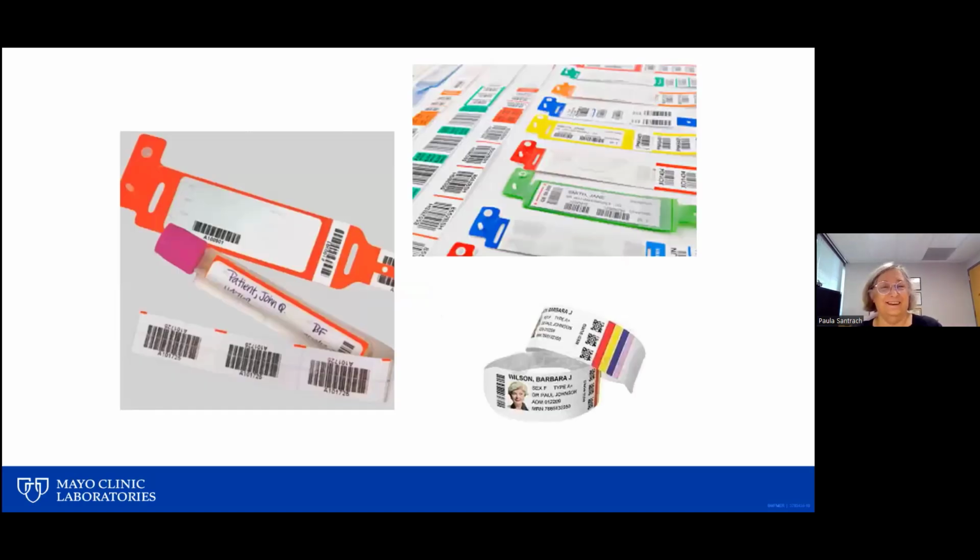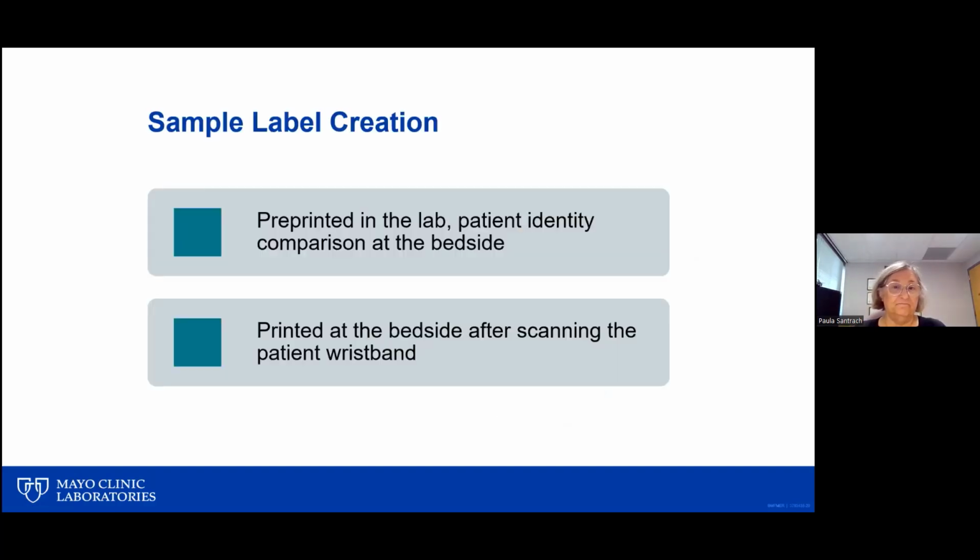So armbands, just to give you a sense, there's all kinds of them. And it's interesting, here's one where you actually have the patient's picture on the armband. I don't think that's necessarily common, but they can have a lot of different armbands at the time. And so again, you need to make sure that the one that you need is the correct one. But for most of these blood bands, there's also an identifier on that band as well. And so you have another thing to check to make sure that this is the right patient you're going to give that blood to.